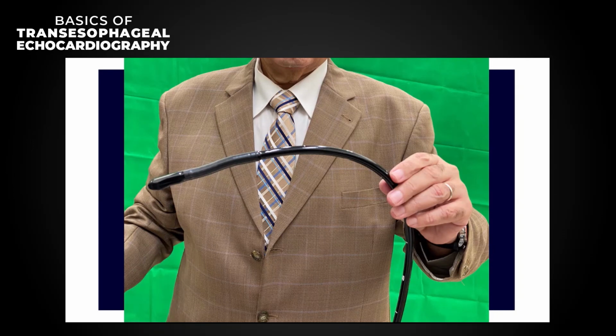How to use the TEE for diagnosis of pulmonary embolism? Yes, that's a very good question. Look, for pulmonary embolism, the gold standard for us is pulmonary CT angiography. We usually don't do a TEE to diagnose pulmonary embolism.